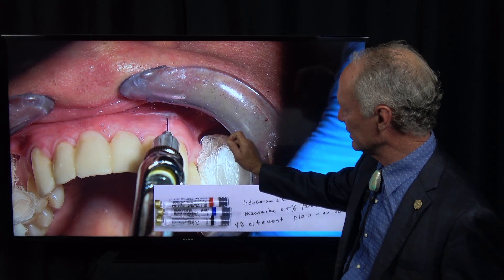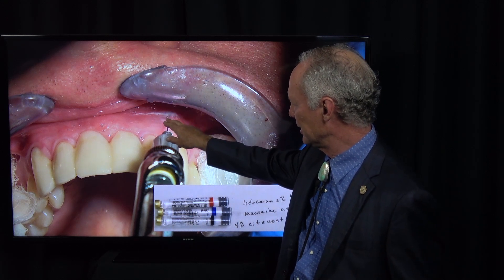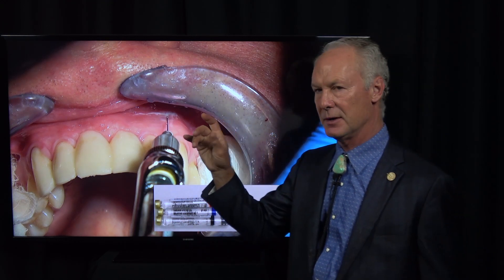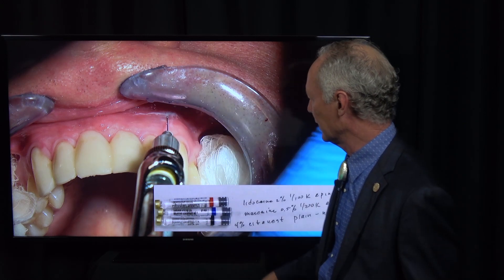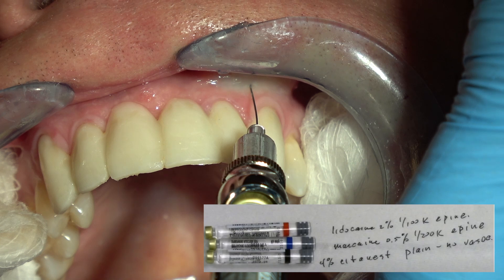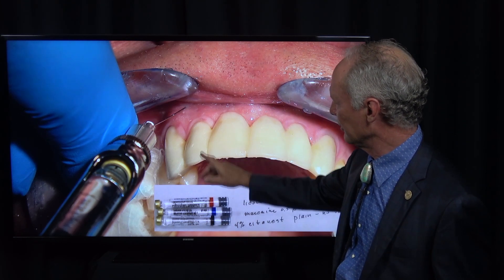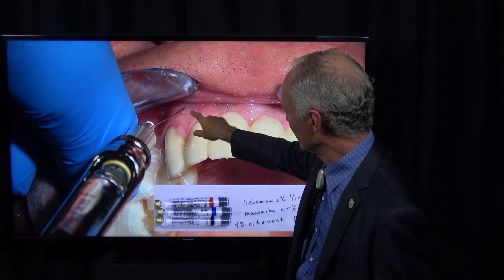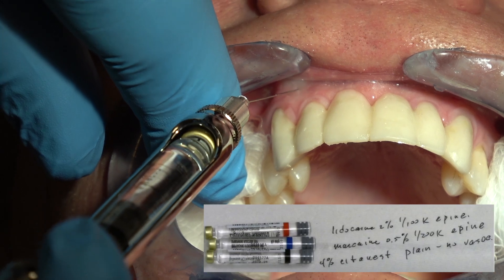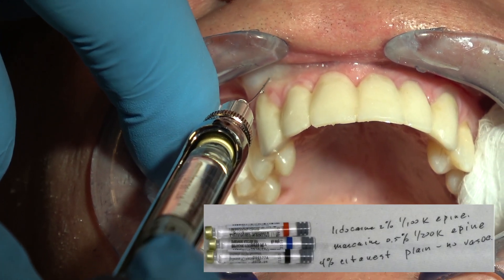Just take the tip of that 30-gauge needle and barely pierce the tissue right at the junction of the attached and unattached gingiva, with the bevel toward the bone. Just barely pierce that tissue and tap the end of the syringe — just tap it — so just a little bit of local anesthetic goes out into the tissue. Then go a little bit further and keep tapping, because if you squirt too much in at one time the pressure can be painful. I'm placing the local anesthetic right at that junction with the bevel toward the bone.